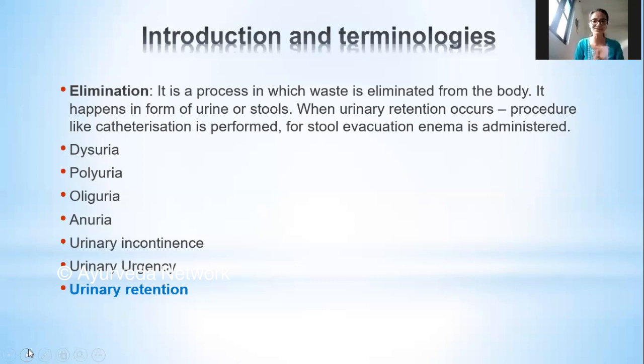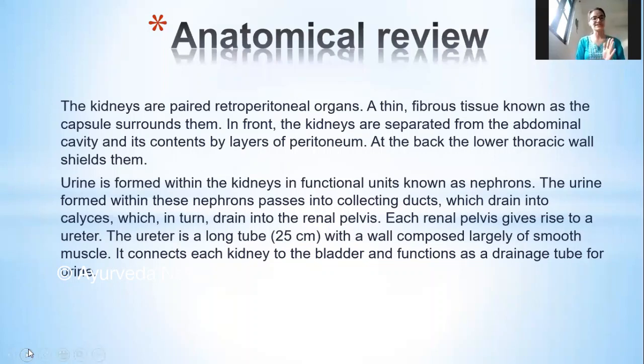And if nothing works, then there are certain maneuvers, like the Credé maneuver, in which you are not doing anything much, but just doing some abhyanga or massage over the abdomen, and hot water fomentation. Even Acharya Charak has mentioned this, like abhyanga, avapidak, and sweda, when there is mutravega avarodha, and it has also been mentioned in the chikitsa. So these are certain maneuvers or common management. But if nothing works, then you have to go for catheterization. Let's switch to the next slide.